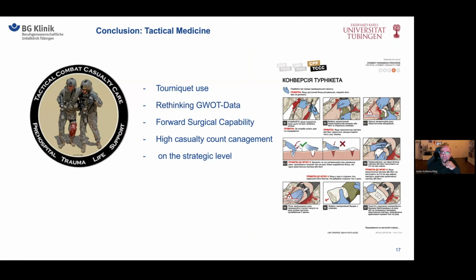Thank you. Jonas, maybe you have some experience. Not so much with the loosening, because the oldest data we have is rather old, and it's different implants. So I think Richard could tell us more about this. But I know that there's a study from Walter Reed, which has the largest series, before Alexander took over the largest series, I think. And they have really low loosening rates in the upper extremity, and a little bit higher in the lower extremity. But overall it's a valid concept, and you have to think of one thing, that in the rightly selected patients, it's your only chance to preserve mobility. So you don't have that much to lose.